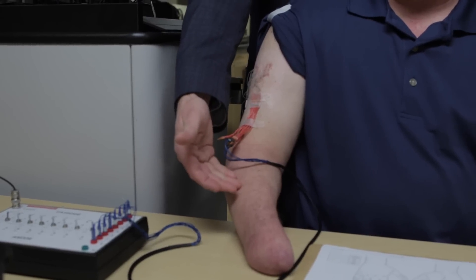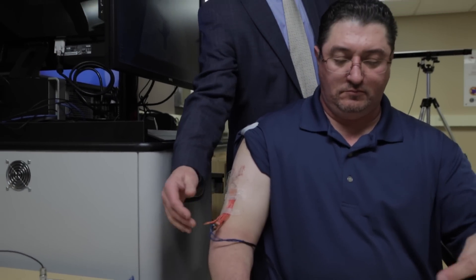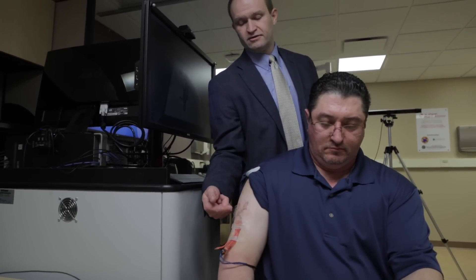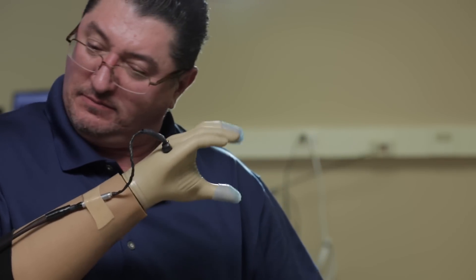We've placed electrodes in Igor's forearm, about at this level, that connect directly onto the peripheral nerves. There are wires underneath his skin and then out to the site here that we can connect to an electrical stimulation system. That signal travels up to his brain and then he feels as though it's his hand.